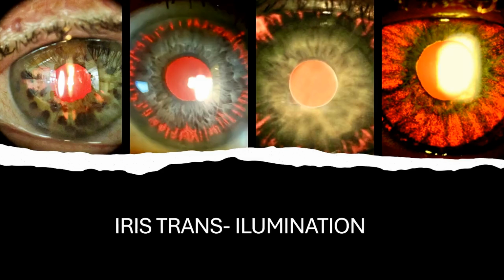Transillumination is a very useful technique to ensure the anatomical and structural integrity of the iris because it highlights areas of the iris where the posterior pigmented layer has been destroyed, which, as we all know, is the one that provides protection against ultraviolet rays.